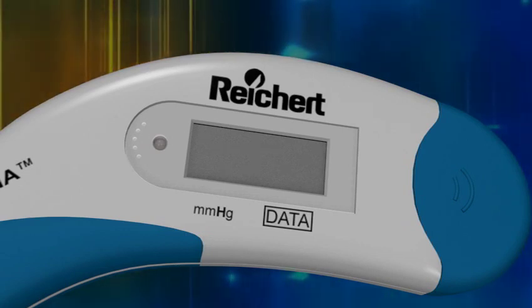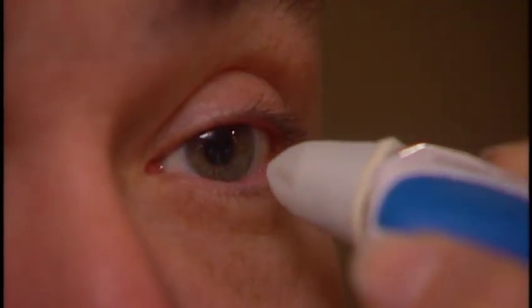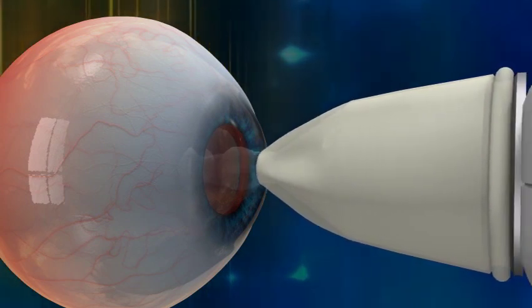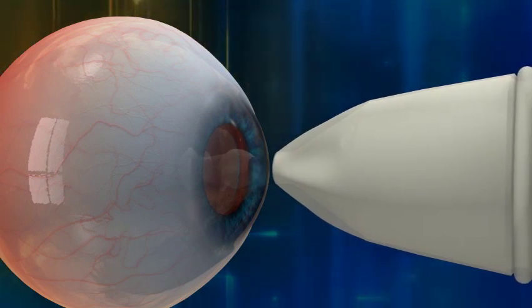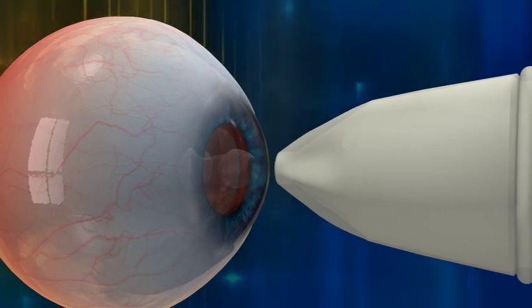After the double row of dashes is displayed, proceed with the IOP measurement. Gently applanate or tap the transducer on the patient's anesthetized cornea. Notice how the Tonopen Avia Tonometer is perpendicular to the cornea and the taps are light, quick touches. You will hear a click sound with each applanation. With ideal technique, you will hear two clicks for each touch of the eye, signaling that a reading was taken on both the inward and outward applanation.